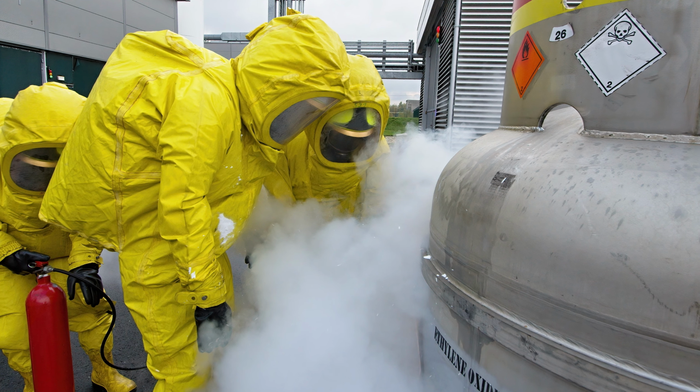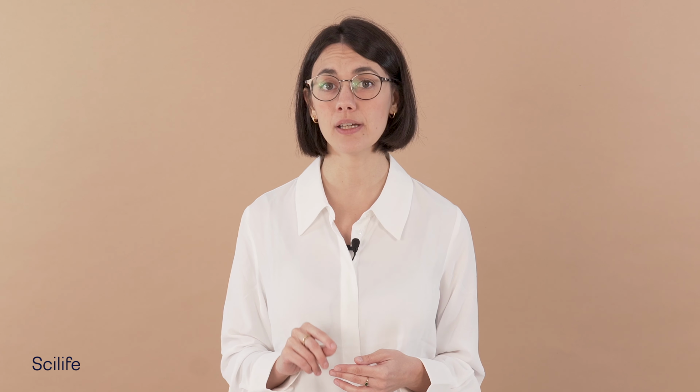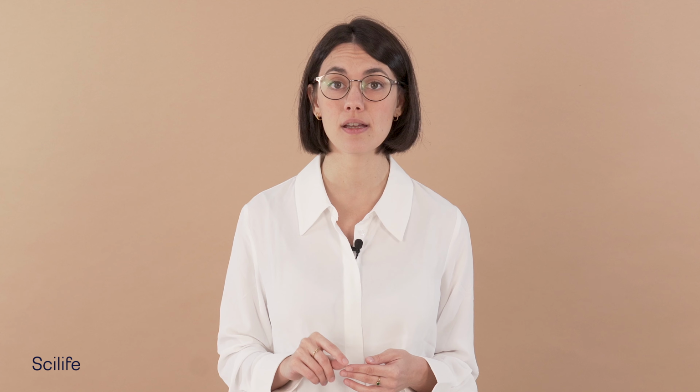But unfortunately, all that glitters is not gold, and there are some disadvantages too. Ethylene oxide is a colorless and odorless gas at 430 ppm. You need to be careful with safety precautions. It is flammable and explosive. It has potential hazards with patients and staff. Exposure can cause eye pain and sore throat, difficult breathing and blurred vision, dizziness, nausea, headache, convulsions, blisters, and can result in vomiting and coughing.